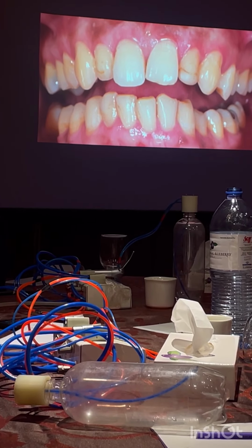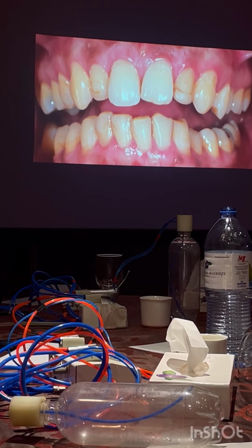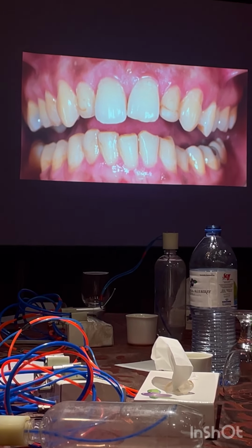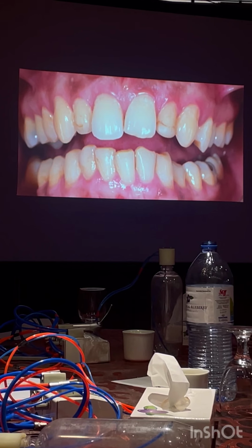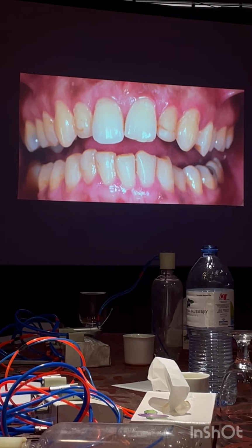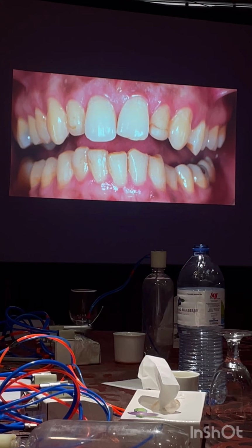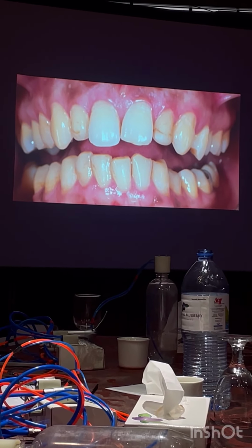Now, who is at fault? Is it the operator or the material? It's the operator, because he has not finished and polished well. What has this operator done? Usually you see how most of them finish and polish composites. Once they finish composite, they will use one red ring burr, go once or twice like this, then they'll take bonding agent, apply, light cure, show the gloss to the patient, the patient is very happy, and it's done.